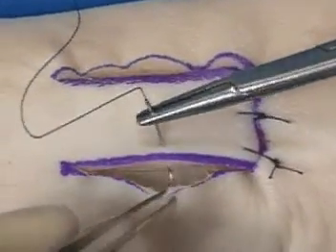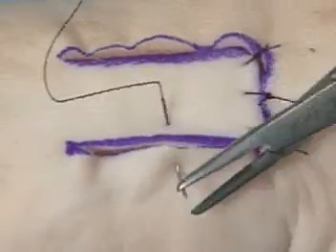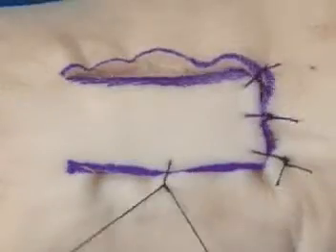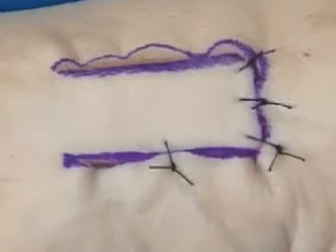We will then close this with the principles of halving. The first or central suture is placed in the middle of the inferior edge of the flap and in the middle of the corresponding skin flap.